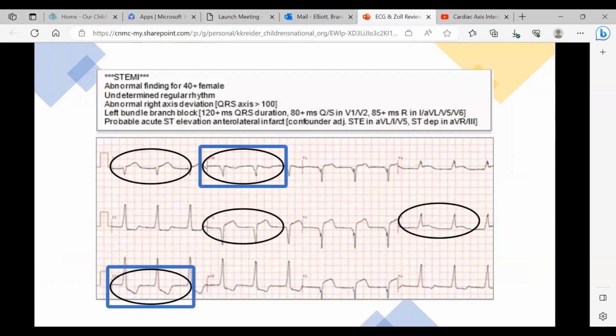So the notch, the bunny ear, is an indication for what? It's an indication for bundle branch block. And depending on which way it deflects first, there's going to be a left or a right. So the little double QRS is going down, so is it a right or left? Yeah, I think of it as the turn signal rule. I would say left hand.